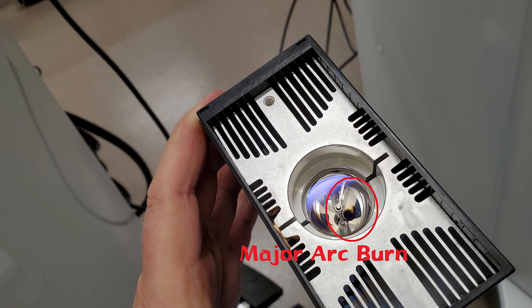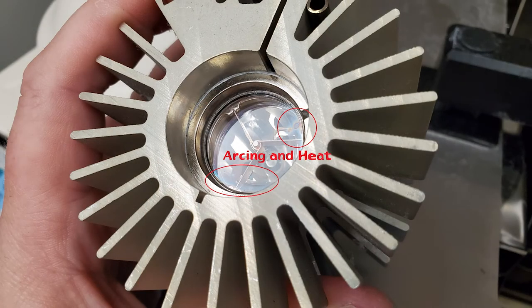Here's a Zeiss Knievo bulb with major arc burn to the parabolic reflector — this bulb probably has about 350 to 400 hours. Take a look at this bulb: you'll notice two effects happening to the glass. In the upper right-hand corner there's a hot spot that has created an anomaly in the glass, and in the lower left there's some splatter and clouding happening on the edge of the glass.